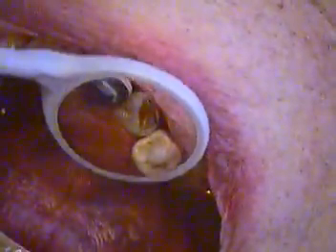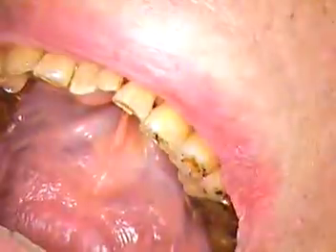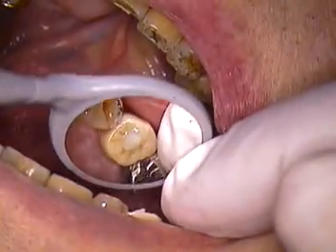We can get out of this procedure a little early. Rich has got to come back for that cuspid — something fell off of that tooth, or he's got a void in it. And I think we can follow up on things, check his bite, etc. With that being said, I'm going to go ahead and adjust the bite. It polishes pretty nicely too, ParaCore — so I have no problem with that.